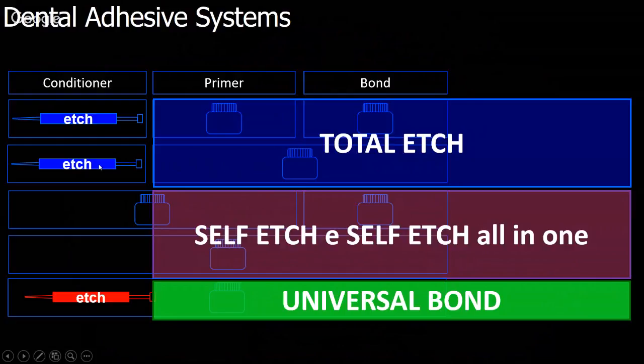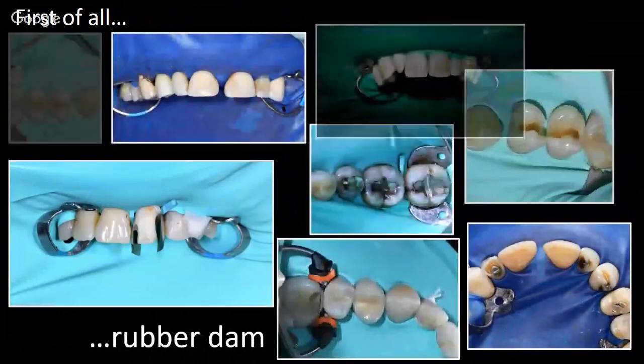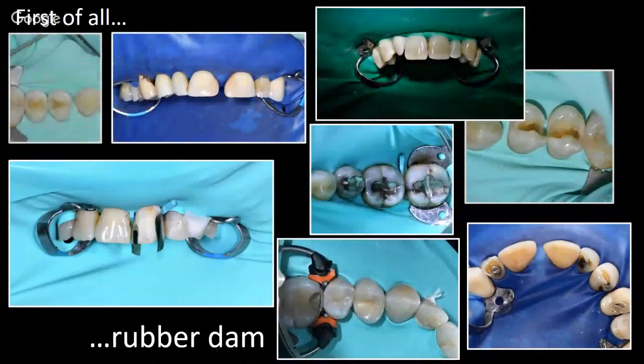And it's funny because it is the most spread all around the world. But I'm telling you something else: the best adhesive system in the world is another one, and it is this one that I'm showing you right now. So it doesn't matter actually which adhesive you are working with. What is important is the rubber dam.